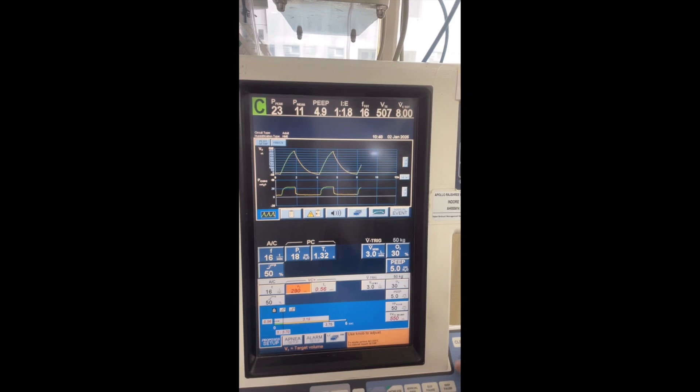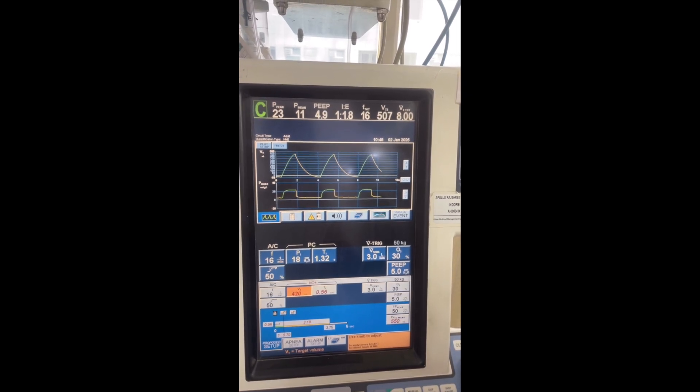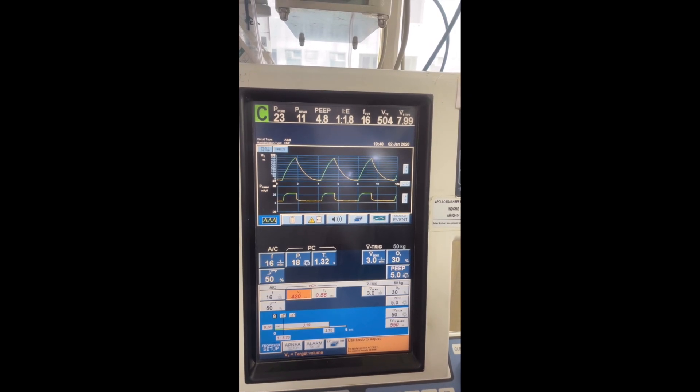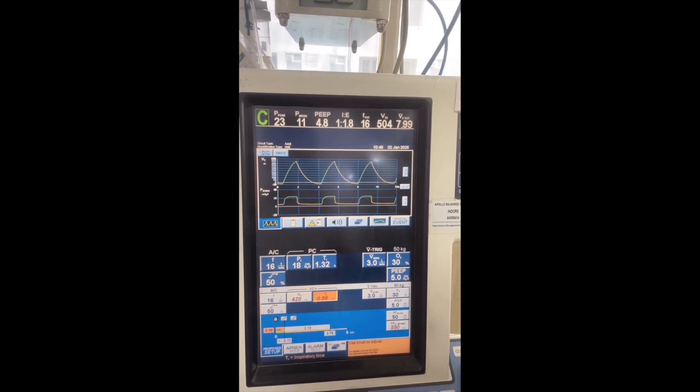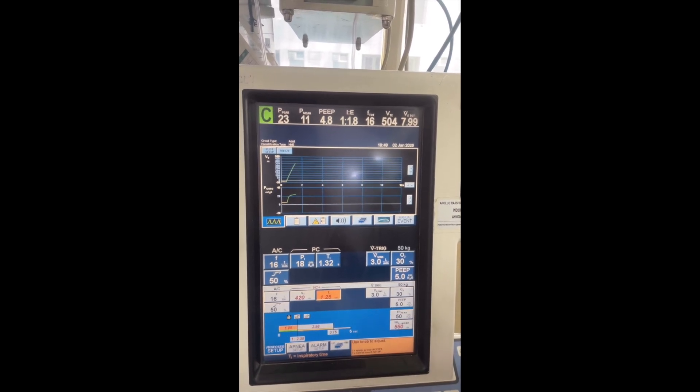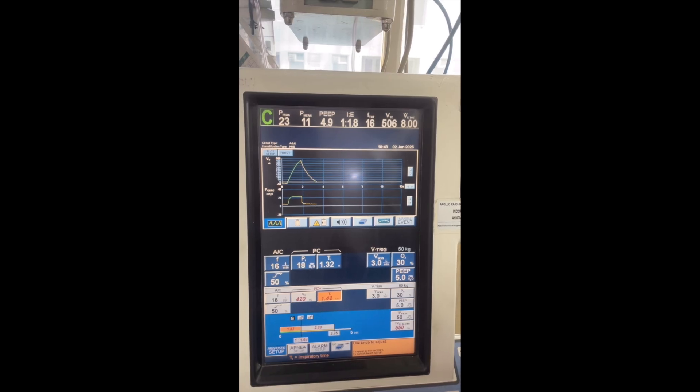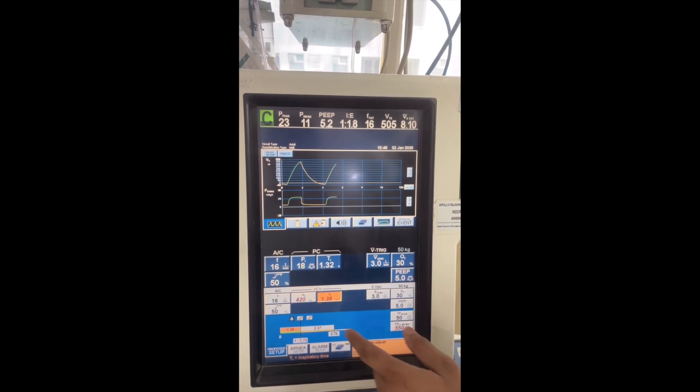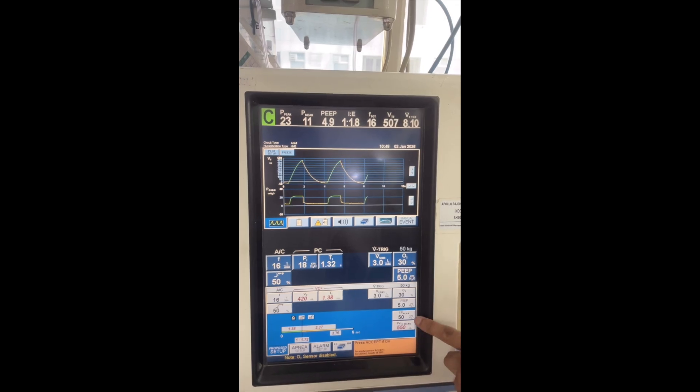But here we have a different mode called VC Plus, which is actually the PRVC. In here we set the desired tidal volume, like I want 450 tidal volume or 420. And what should be the I:E ratio - this is the inspiratory time.